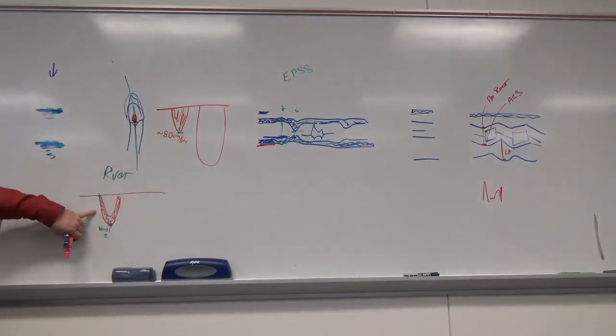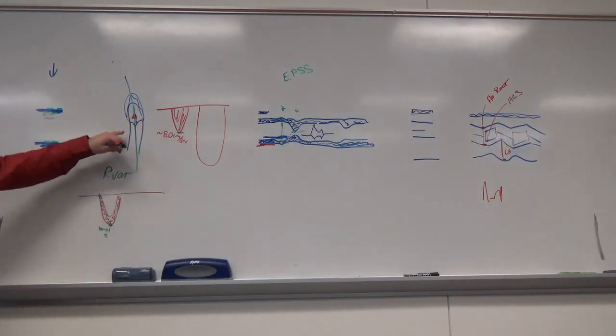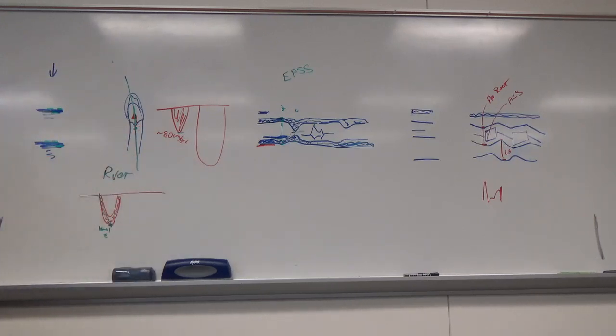So this one we do an acceleration time before the valve. Then we take off the gate and we just go through the valve with continuous wave Doppler. You're going to put that kind of through the tip of the valve, and you're going to measure the peak velocity of that. So everything we do on Dopplers we'll talk about in physics. You want to optimize your spectral settings so that we minimize the room for error for measurements.